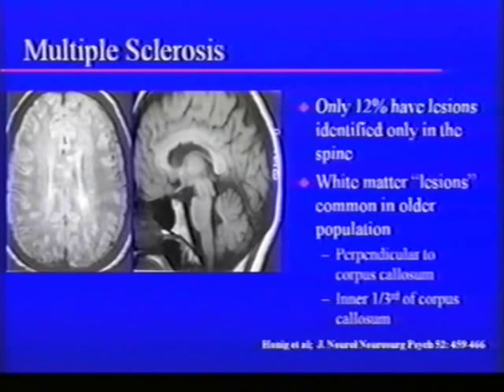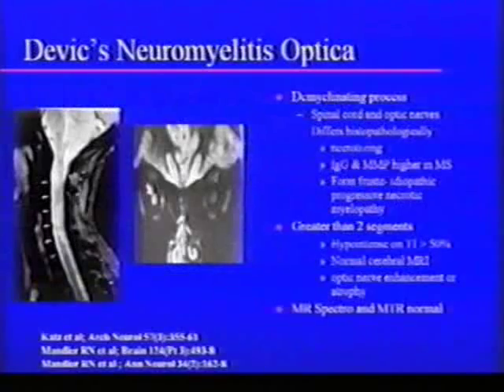There. What that is that's involvement of an area of the corpus callosum that has a whole lot of blood supply. It would be unlikely to be ischemic. So if on the sagittal image you see these lesions on the inner 1/3, that again supports that they're not ischemia, but rather much more likely to be an MS-type lesion, because the corpus callosum is very resistant to most types of lesions.